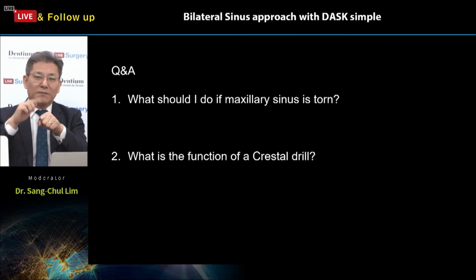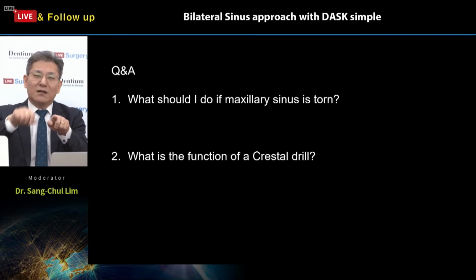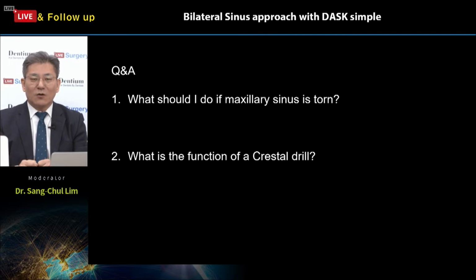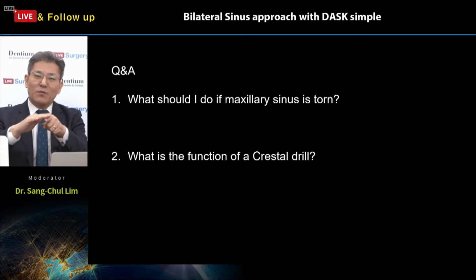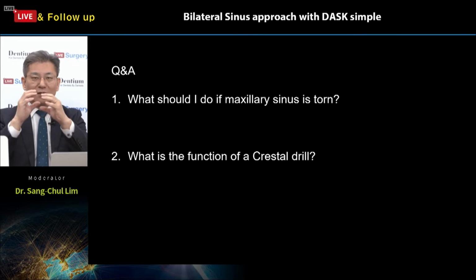How? Actually, the tearing point is here, and stop touching this area anymore. Far from this tearing area, we make another window, right? Then the detaching procedure restarts with the fresh sinus membrane, little by little, until the membrane is detached from the sinus floor and lateral wall, where the perforated areas automatically overlap because of sinus membrane flexibility, right?